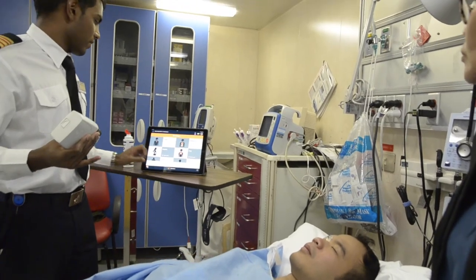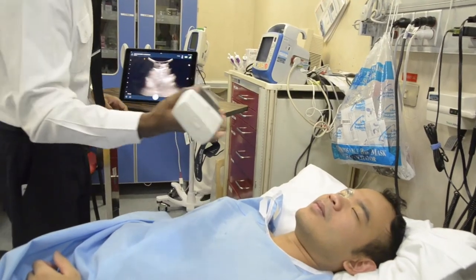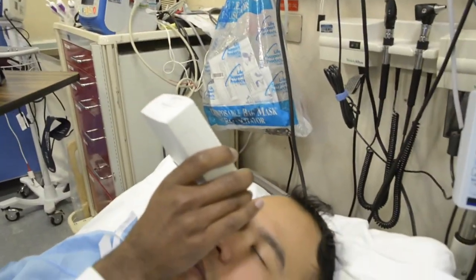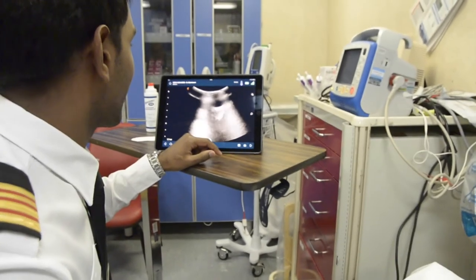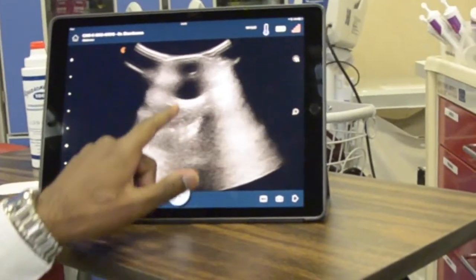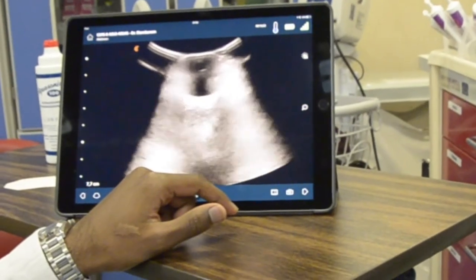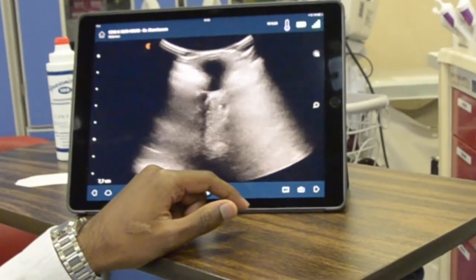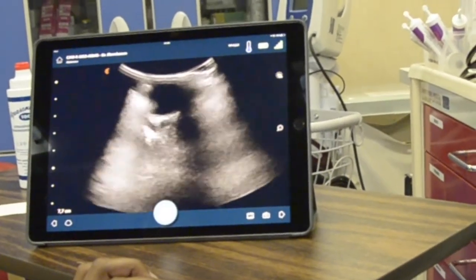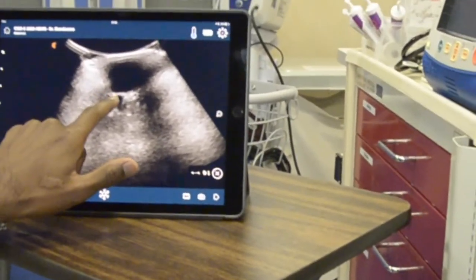Ocular ultrasound is really nice for retinal detachment — I'll show you now. There's the eye. There's the lens, there's the back of the eye. It's difficult to get the optic nerve — oh, there we go. So if you see a retinal detachment, there's stuff floating in here. Now you can measure the optic nerve — let's do that. We can try and measure it.